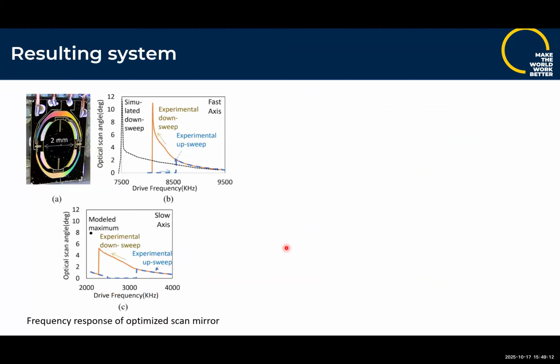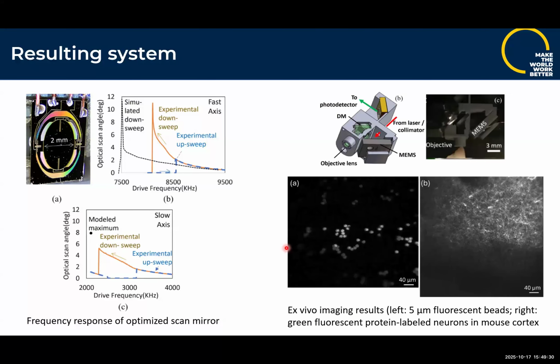And so here's one of the finished mirrors from this device, from this process used in this multi-photon imaging system. Again, it's a non-linearly actuated system. So in fact, you'll see a bunch of softening dynamics in this particular case, something called electrostatic softening. And then we can plug it into a given instrument.